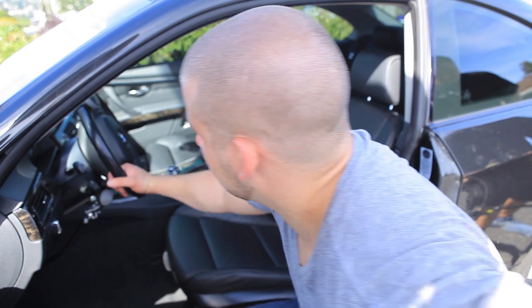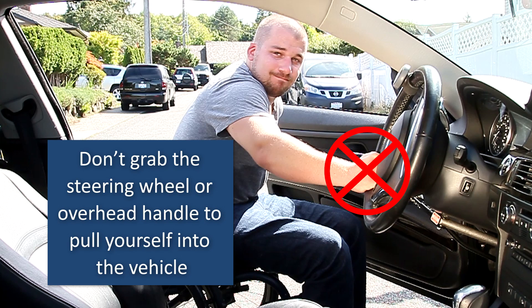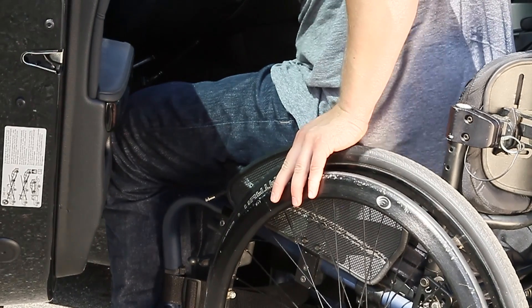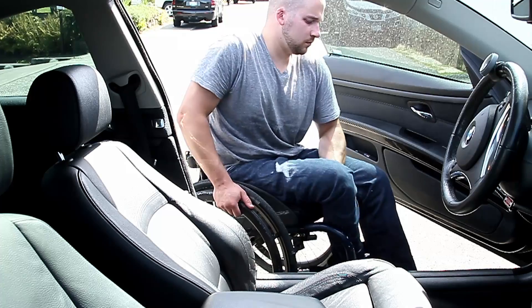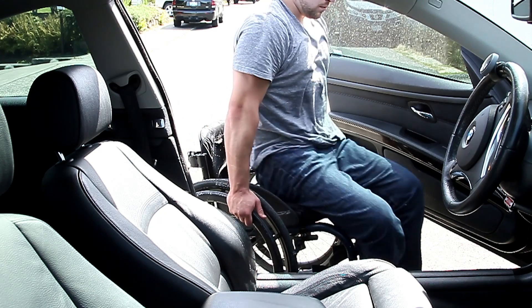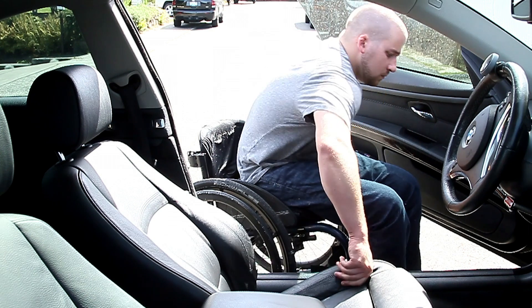Avoid pulling yourself into the car with the overhead handle or the steering wheel. Overhead pulling can harm your shoulders over time and may contribute to dragging your hips across the wheel instead of lifting your hips up and over the wheel. Lean forward while you tilt and rotate your shoulders away from the car seat. Tip forward while bracing with your shoulders and elbows, and lift your hips onto the front corner of the car seat.